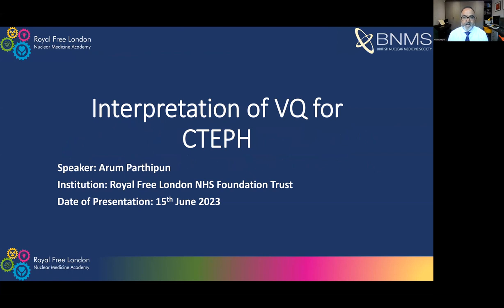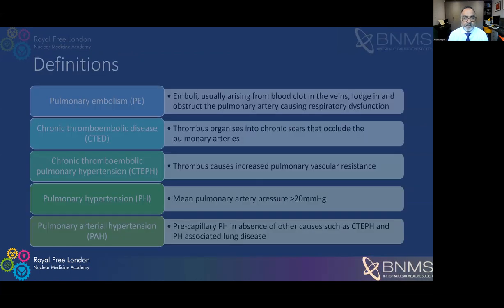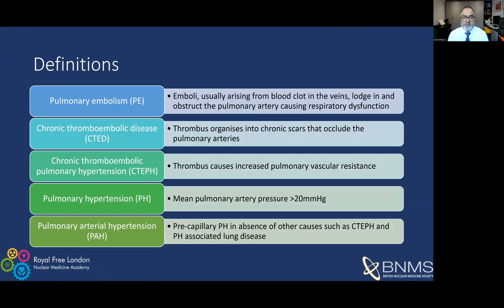Hello, welcome to my talk on the interpretation of VQ scan for chronic thromboembolic pulmonary hypertension. So I think it's quite useful to go through a few definitions before we start.